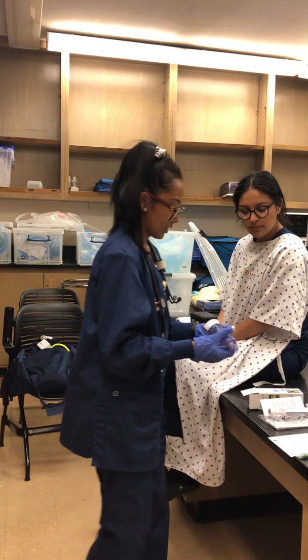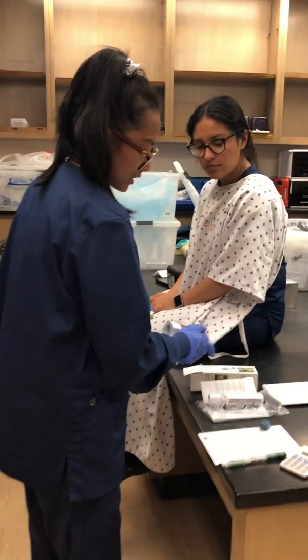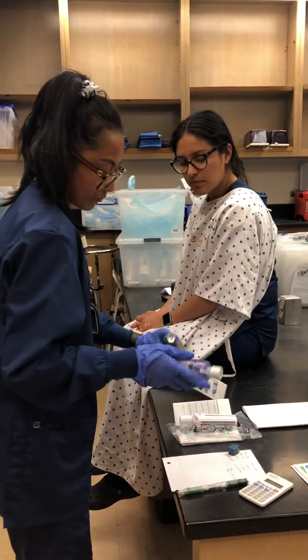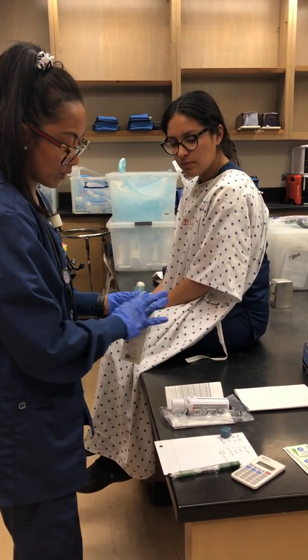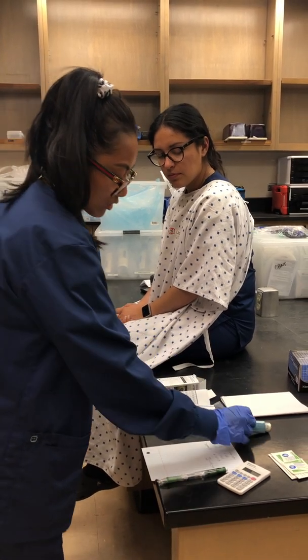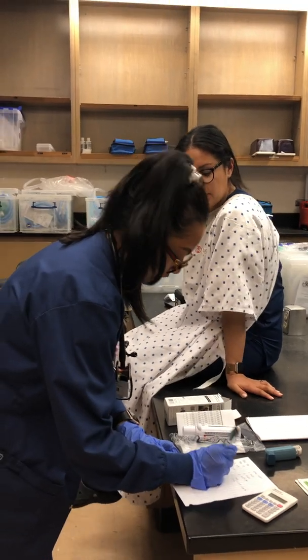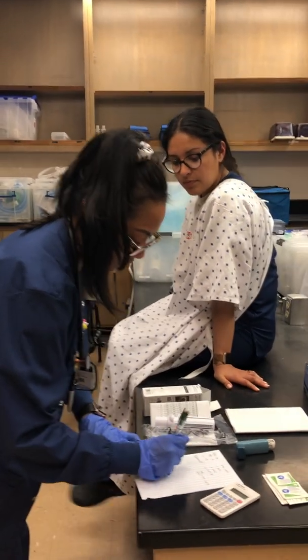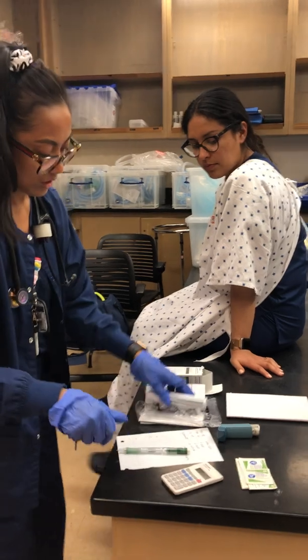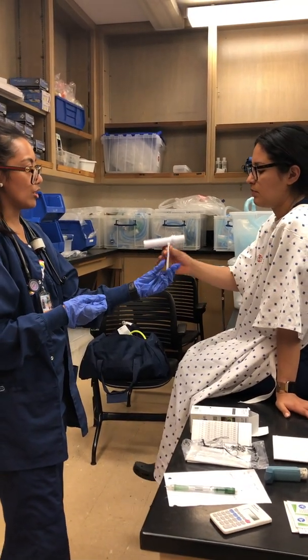Awesome. Okay, now to see if the medication worked, we are going to get some readings or values from your peak flow meter again. Just go ahead and close this. So we are going to do your 3 attempts again, trying to get to the 390. Okay, so go ahead and blow into this because we are going to see if the medication worked for you or not.